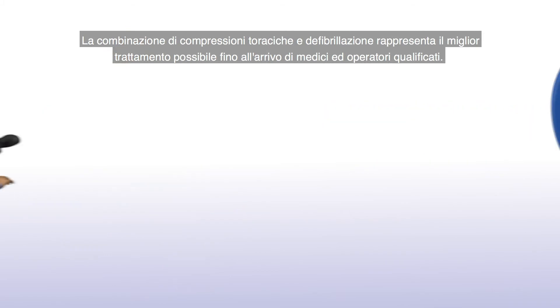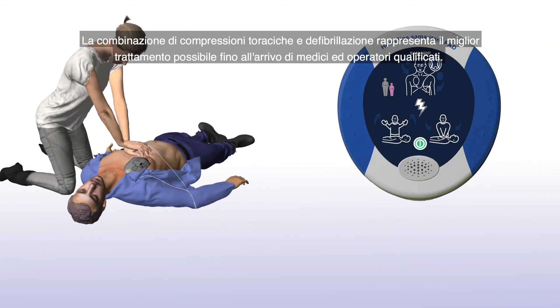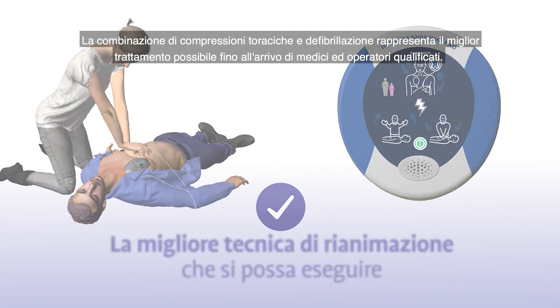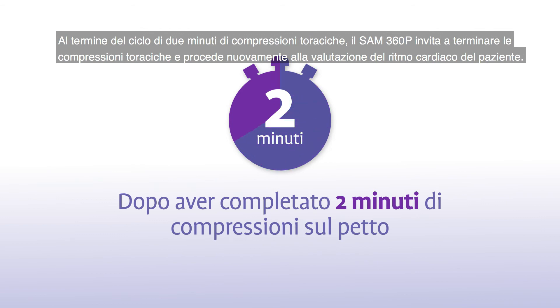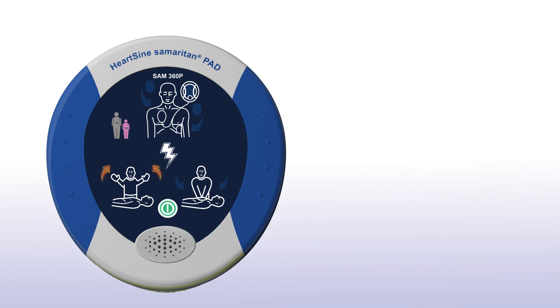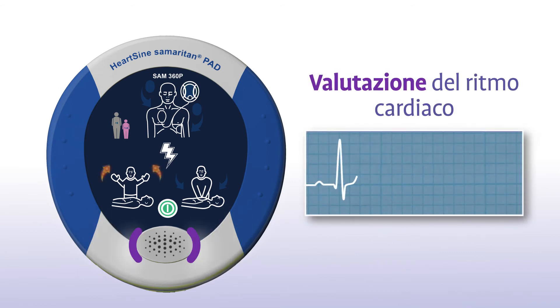The combination of chest compressions and defibrillation is the best treatment you can provide until medical professionals arrive on the scene. Once you have completed 2 minutes of chest compressions, the SAM 360P will prompt you to stop chest compressions and again assess the patient's heart rhythm: "Interrompere la CPR. Valutazione del ritmo cardiaco. Non toccare il paziente."